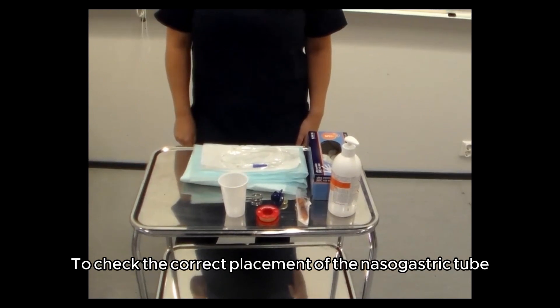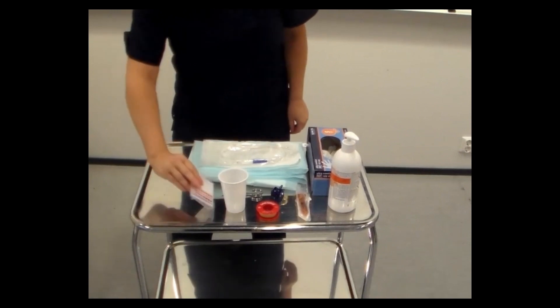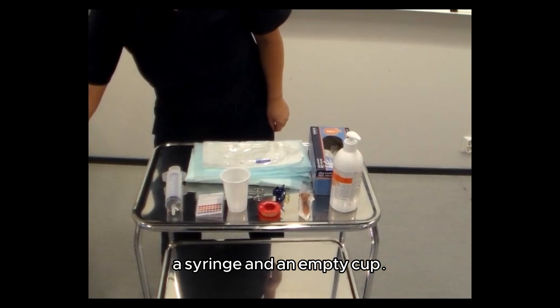To check the correct placement of the nasogastric tube, the following items are also needed: pH indication strips, a syringe, and an empty cup.